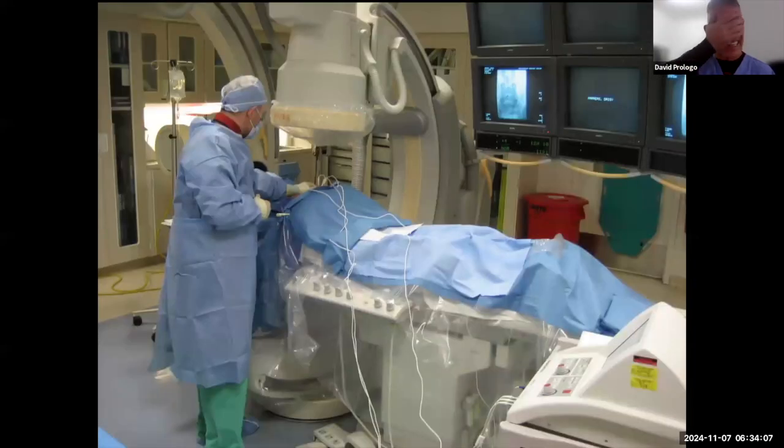This slide snuck in there. I included this many years ago. I was a fellow in this picture. And so this is what it looked like then, and this is what it looks like now. I mean, this generator looks very much like the one we have now. And these are the cords attached to the radiofrequency ablation probes with the patient prone.